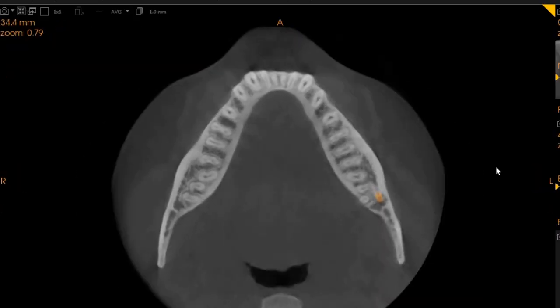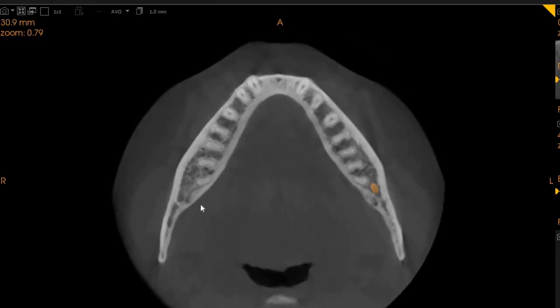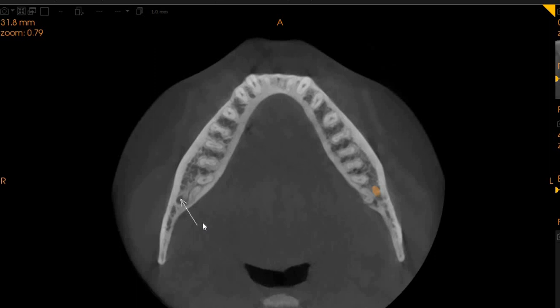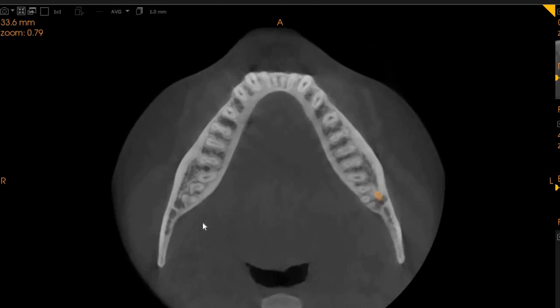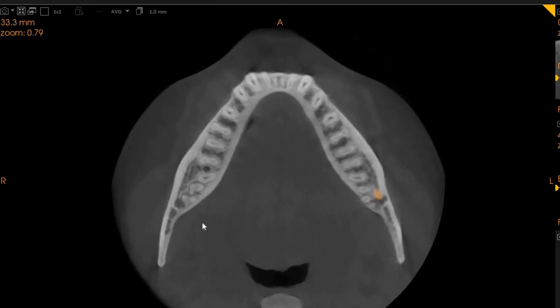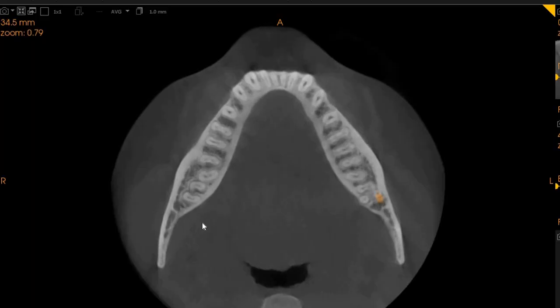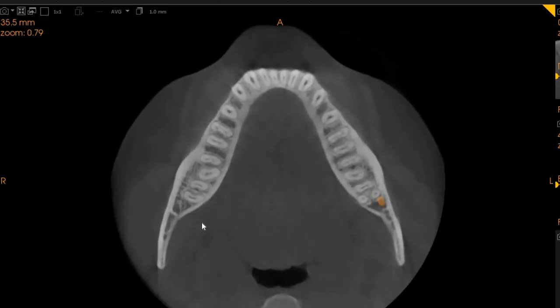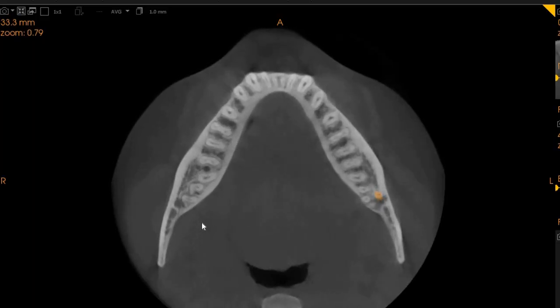This is the axial view, the top to bottom view. Here also you will be able to appreciate that this is where the nerve canal is. As it comes closely in contact with the inferior alveolar nerve, the apex has multiple ramifications in terms of morphology. But other than that, it comes close to the apex, and it is completely safe and free to have this tooth extracted. Thank you very much.